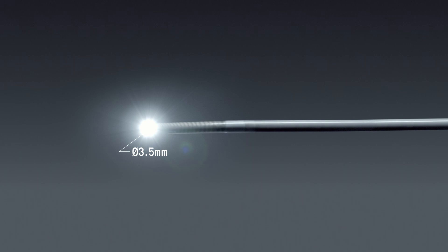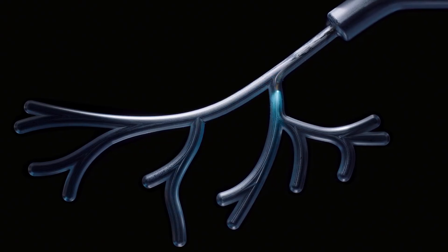Its thin, maneuverable catheter and unprecedented stability can advance your bronchoscopic capabilities and extend your reach.